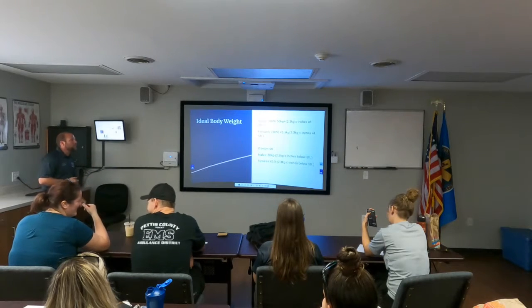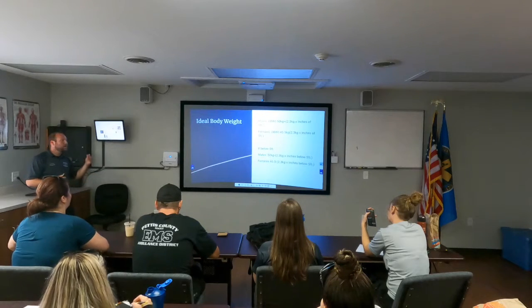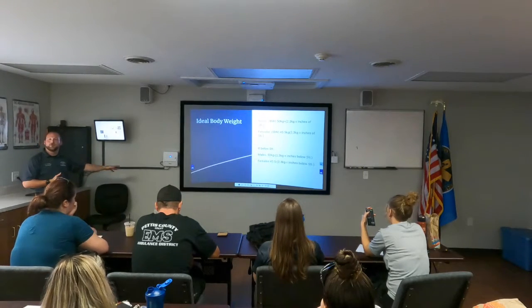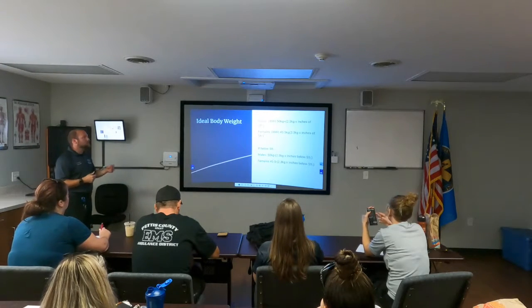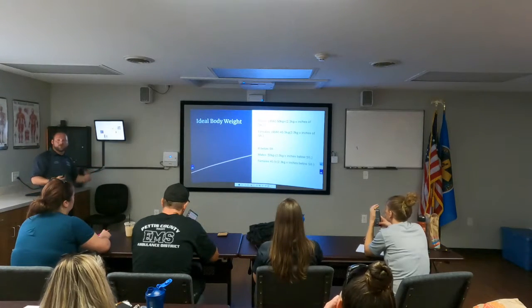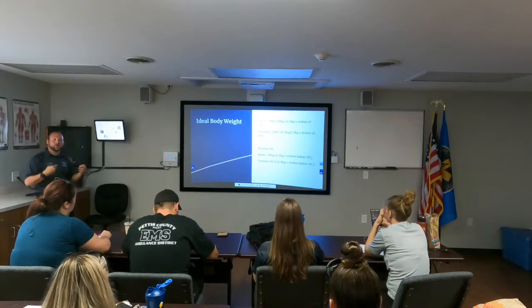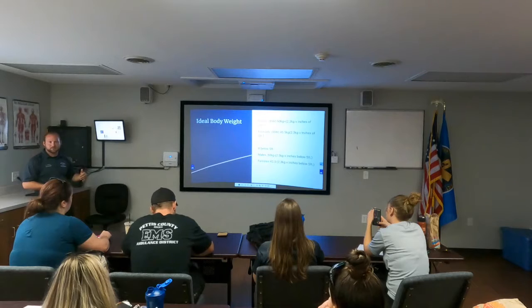If you want to know the calculation for both male and female ideal body weight, for males, the baseline start is at 5 feet, where the ideal body weight is 50 kilograms. From there, figure out how tall they are in inches over 5 feet, multiply by 2.3, and add that to your initial 50. Females are a little bit smaller, 45.5, same aspect, 2.3 kilograms times the number of inches over 5 feet, add it to it. If they're below 5 feet, just subtract.